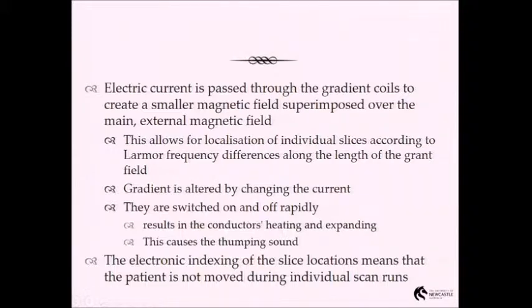It's switched on and off rapidly. This can result in the conductors heating and expanding. I don't think that's particularly important for you guys to know, but it is one of the reasons that we hear all those noises that we hear in an MR scan. I played one for you yesterday, where you hear all those different thumping and clicking noises. Part of that is due to the gradients turning on and off.